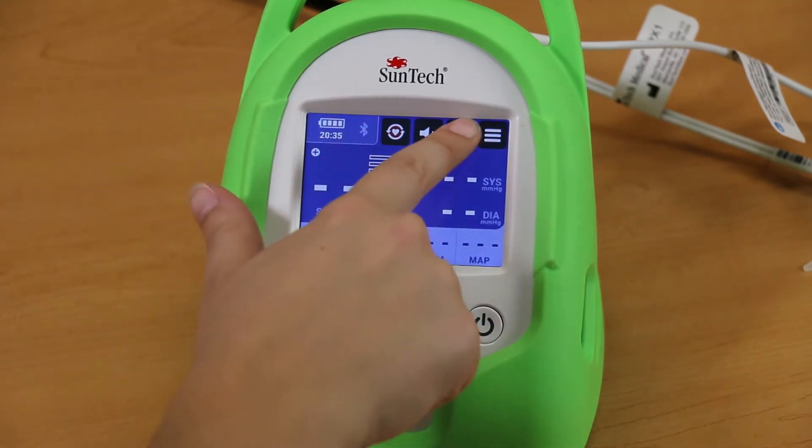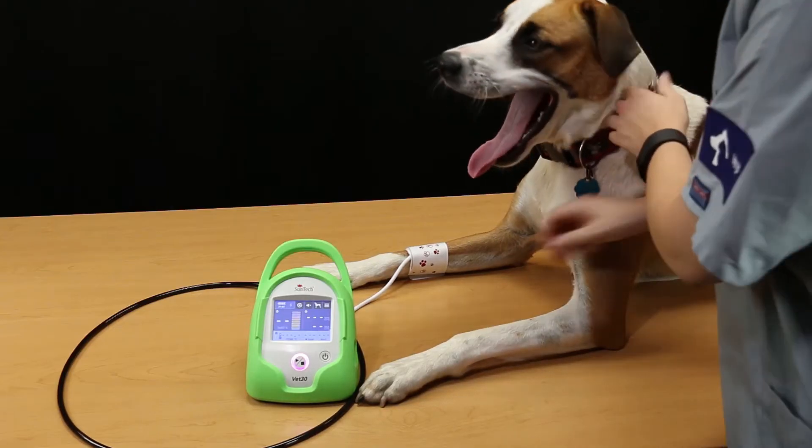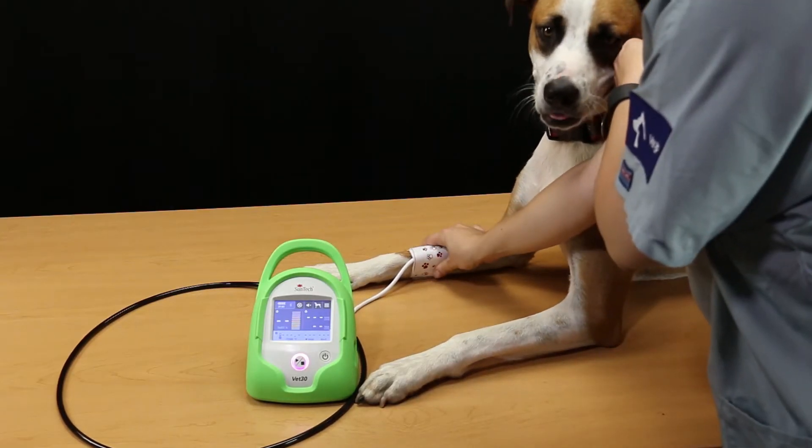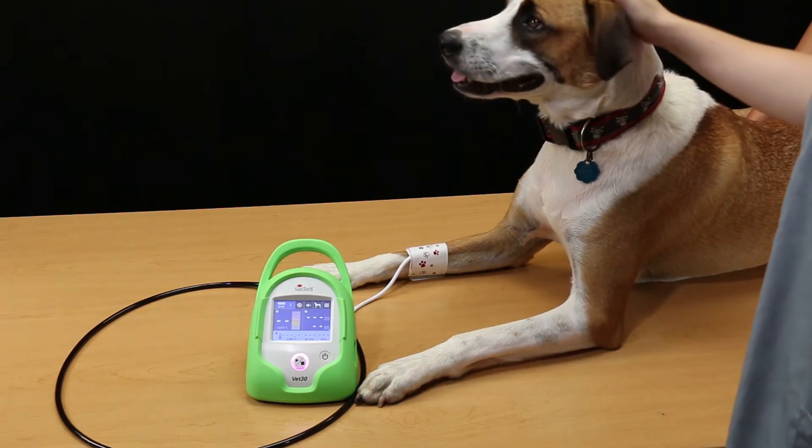To switch modes on the main screen, just press the Animal Size button. For most accurate BP measurement, ensure that the cuff is snug on the patient's limb or base of the tail and that the cuff is at heart level.